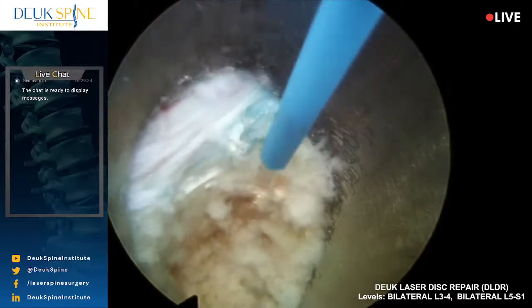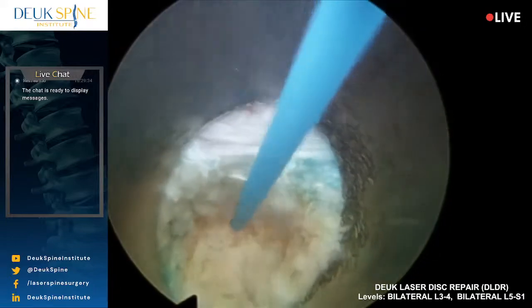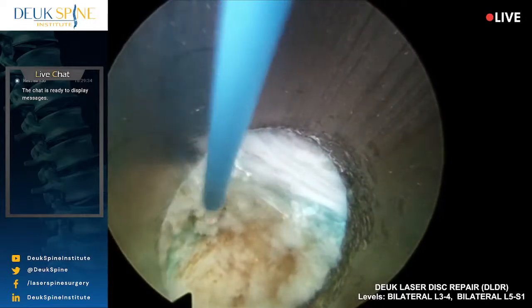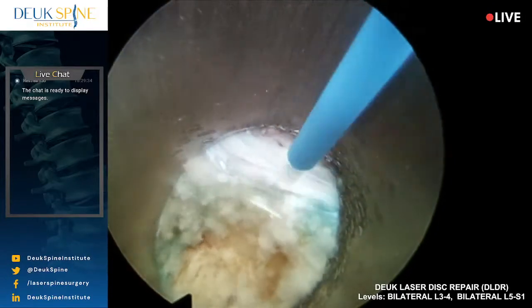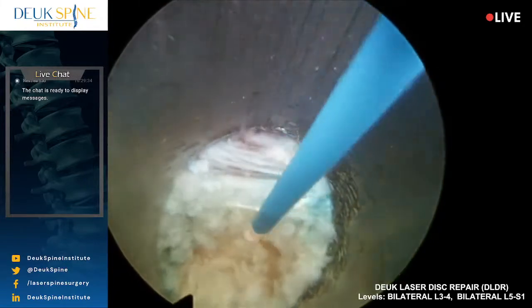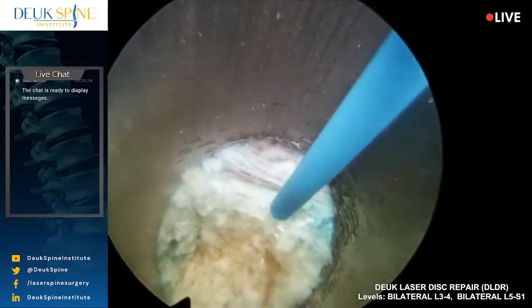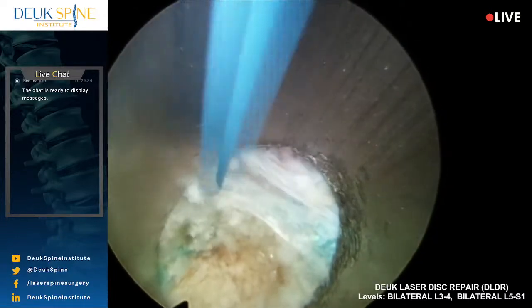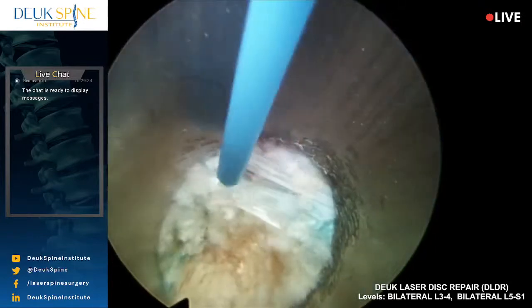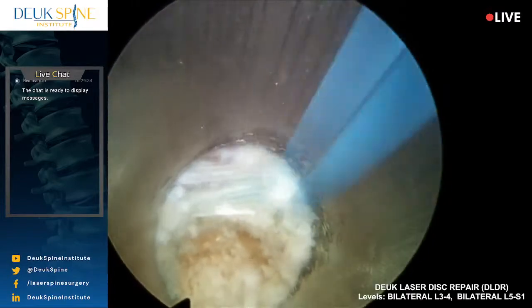So I want to get lateral as well to make sure I don't leave anything behind that could hit the nerve as it leaves the spine and goes down to the pelvic area. This is one of the sciatic nerves, one of the sciatic nerve contributors. So of course, it's eventually going to come together in the pelvic region and travel down.